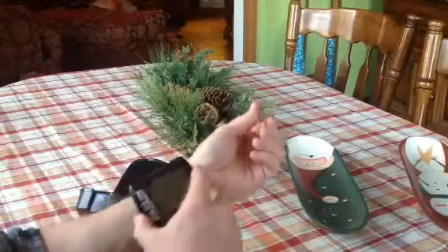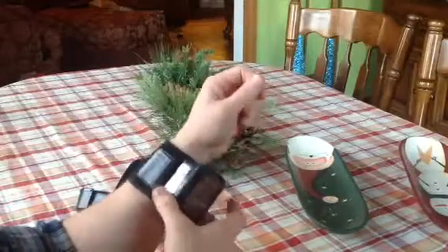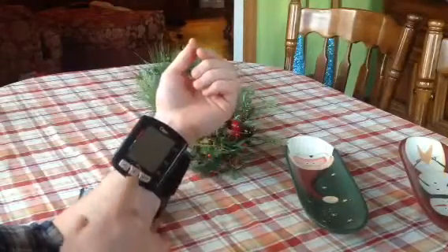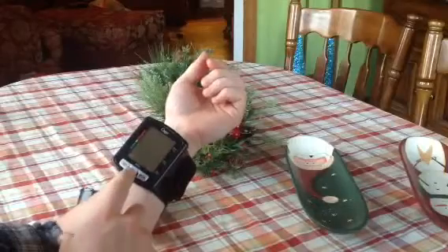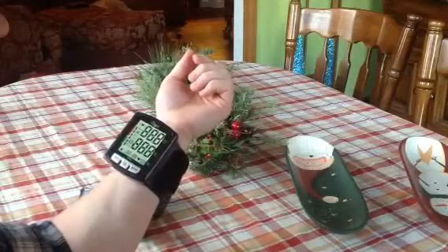Simply wrap it on your wrist about an inch below. There's a little diagram on the side that tells you exactly what to do. As soon as I hit go, there's a lovely lady who tells me right where to put my hand.